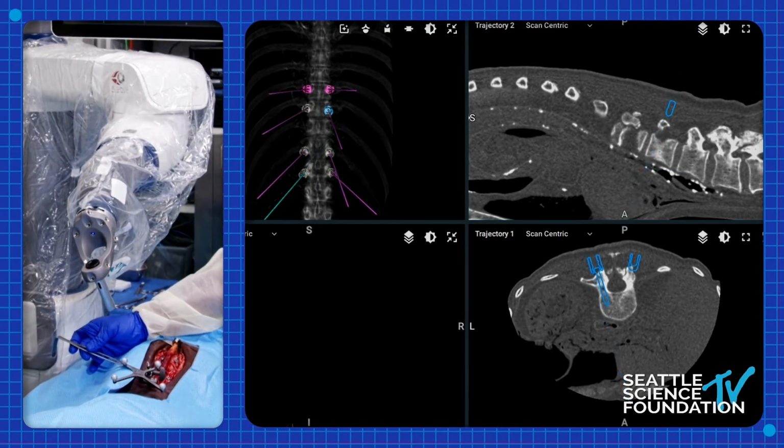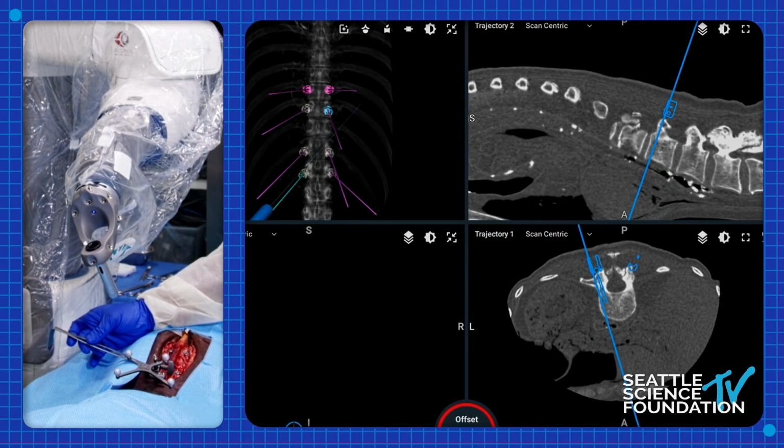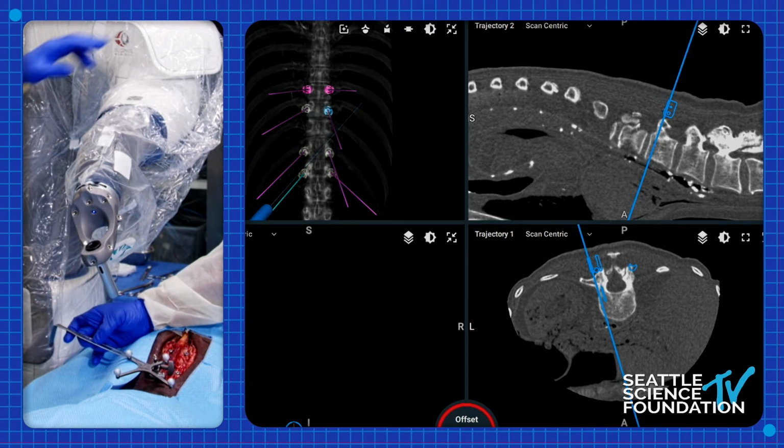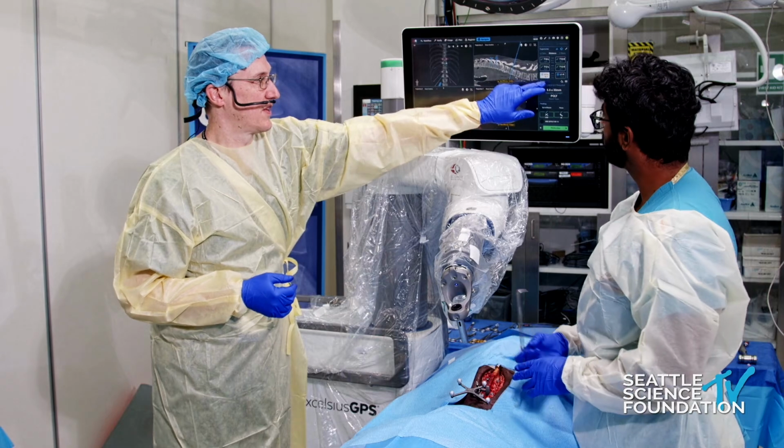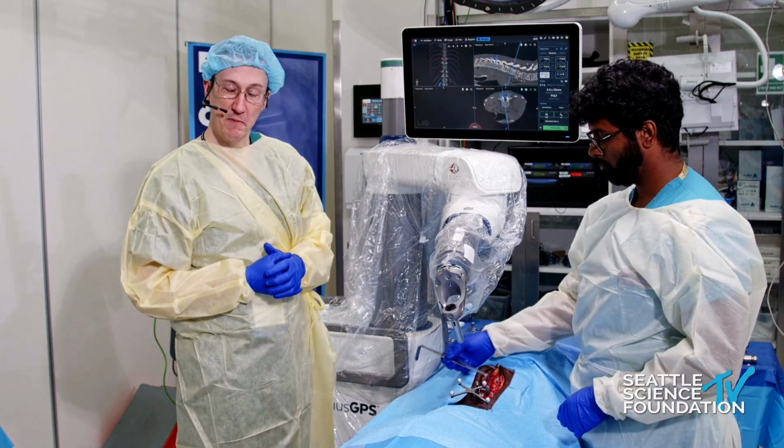I think, if there's any questions about this technology or my approach to its adoption, now's a great time for me to entertain them while we're placing the last screw here. Does anybody have anything for me?